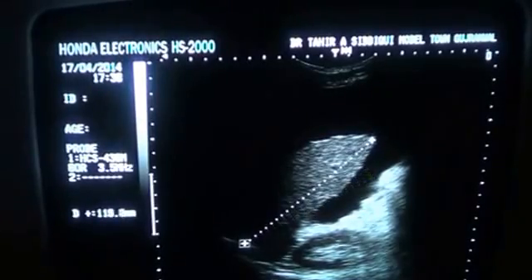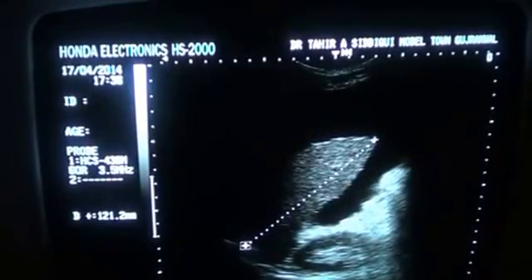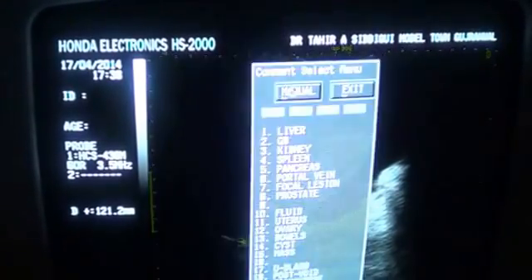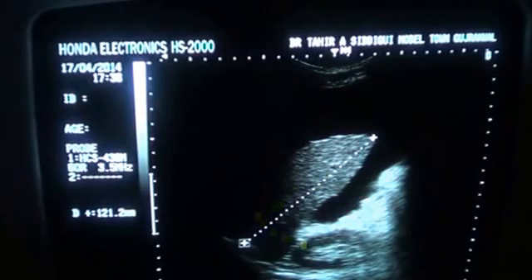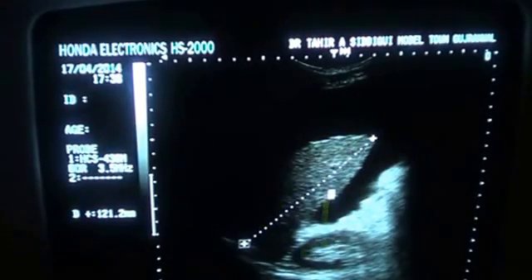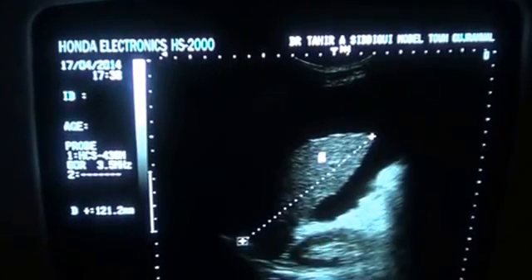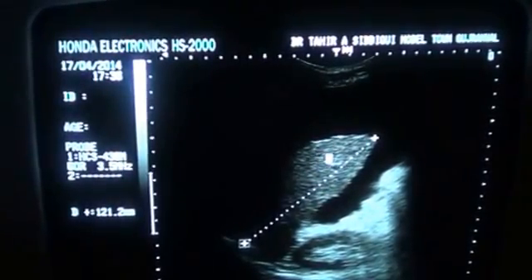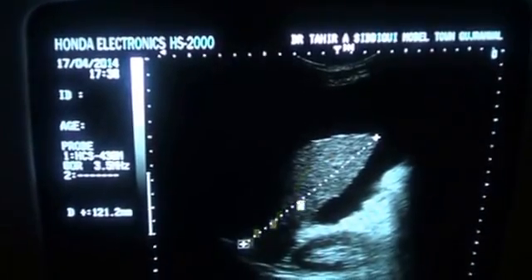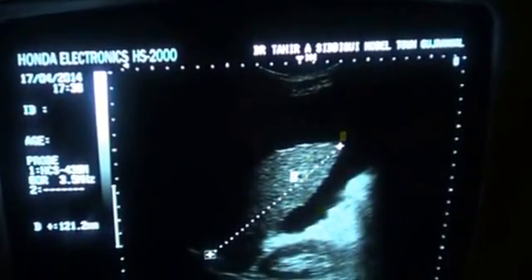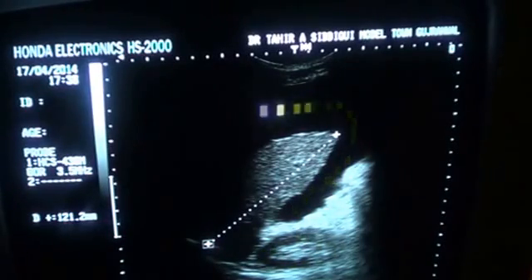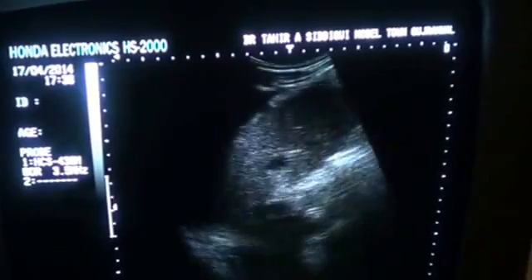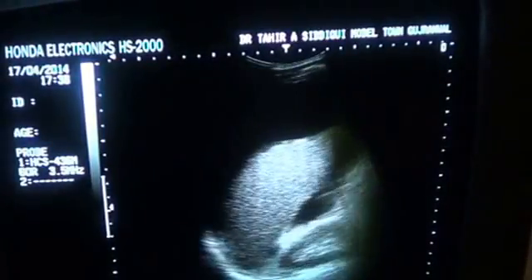The liver shows generally reduced total surface area, measuring 12.1 cm. The normal dimensions of the liver are from 12 to 16 cm. So is the liver really showing generalized reduced total surface area, or is it within normal dimensions? Because we are seeing that if we measure in this scanning frame, this is the right kidney and this is all fluid surrounding the outer surface of the liver. So this is one way of measuring that is in common practice.